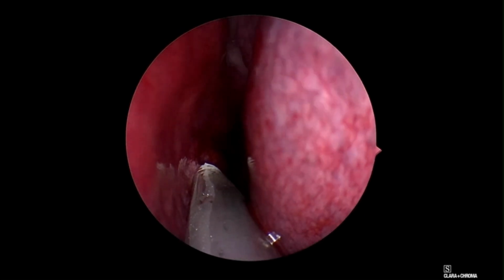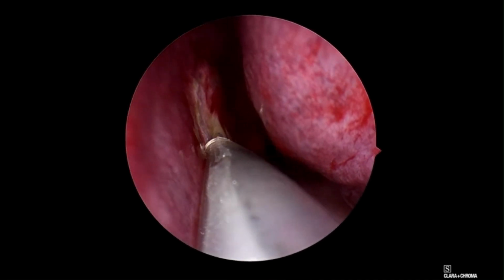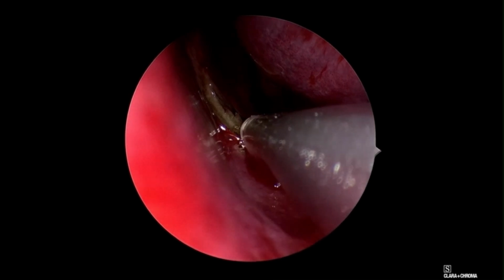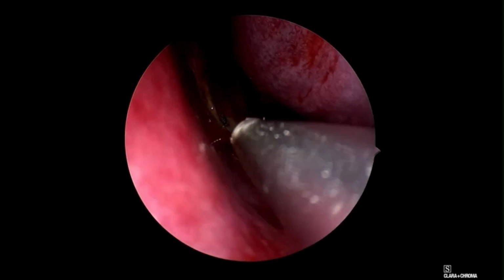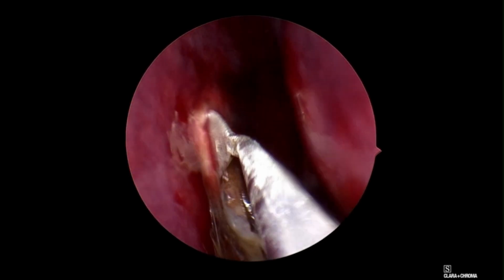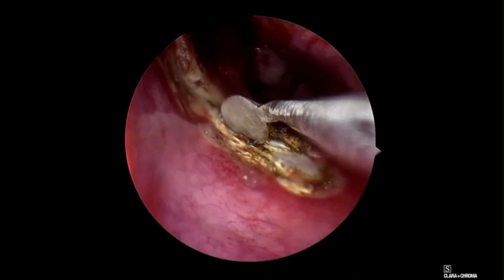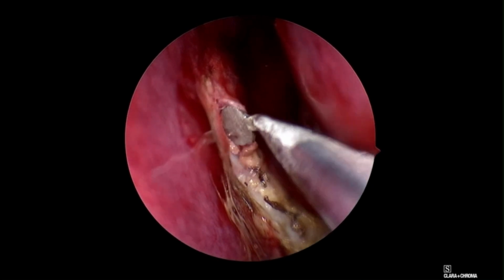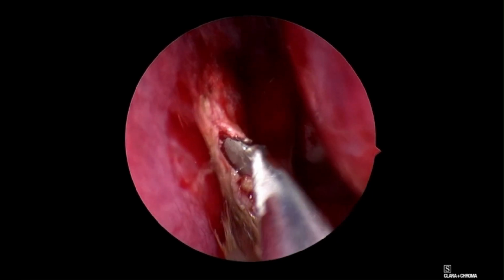I proceeded with the next step, that is raising of the nasal flaps. In the left nasal cavity, I gave the incision so as to elevate a superiorly based pedicled posterior septal flap. I made use of ear microsurgery instruments. Here I'm using a double end knife so as to elevate the mucoperiosteal flaps. I can see the underlying bone. I make sure I don't tear the flap.